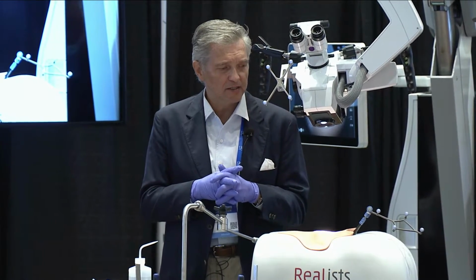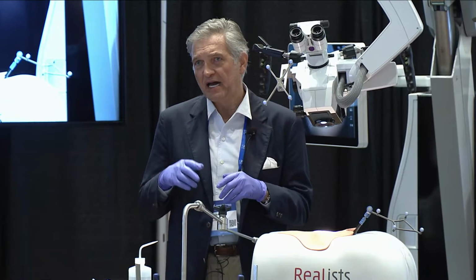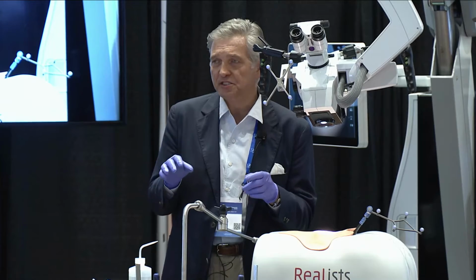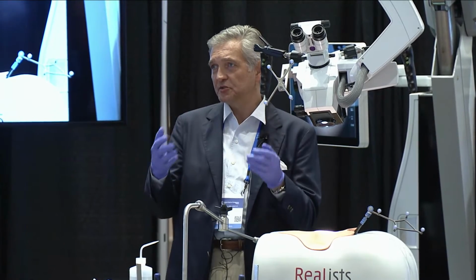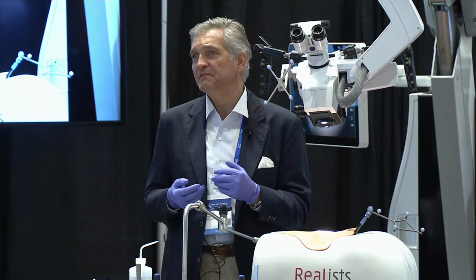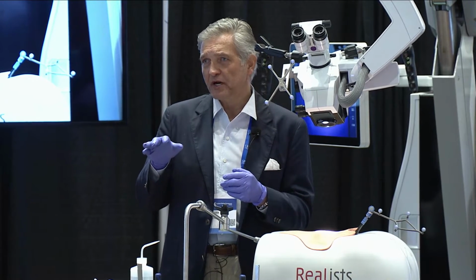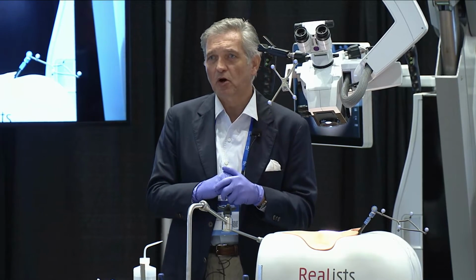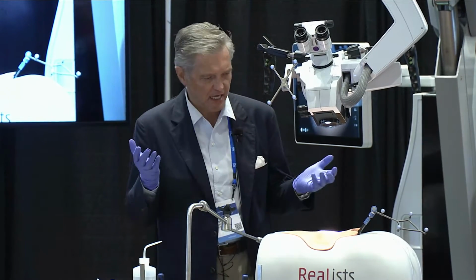And then in terms of the workflow, I like putting in the screws first because that is the more crucial part in terms of accuracy. So you do that in the beginning when the navigation is really accurate. And then the tubular decompression, the facetectomy, the cage placement, that's the second and third part of the procedure. And I'll walk you through that.